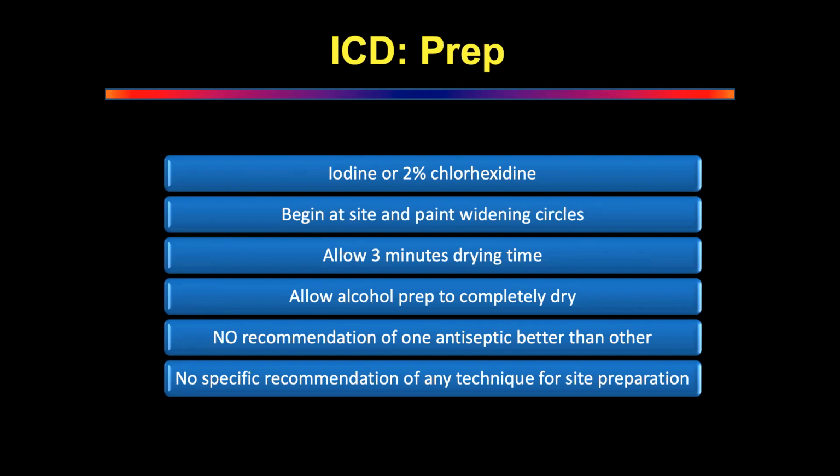Okay. And there are the recommendations. I've looked at everything. There is no recommendation of one antiseptic better than the other. But most of the people talk about chlorhexidine because people may have iodine allergy. Yes, sir. There is no specific recommendation for any technique for site preparation.